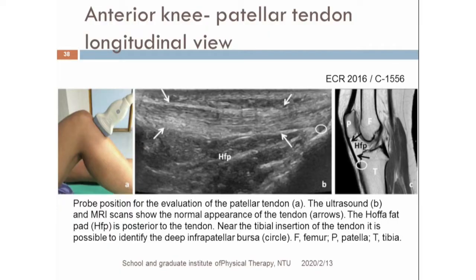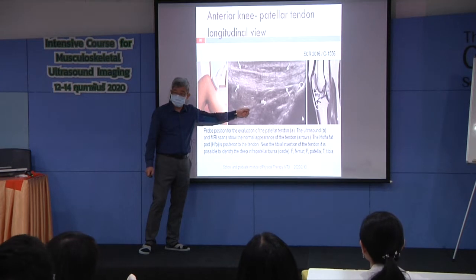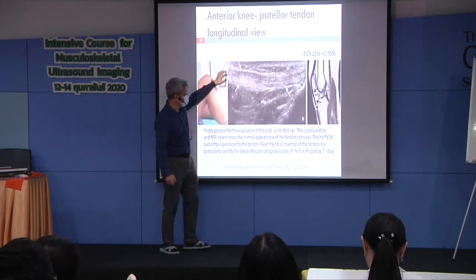Two-layer structures, different to the quadriceps. When you look at the patellar tendons and people show you these pictures, I will tell them, okay, the knee is not fully bent. This is a bridge-like patella.